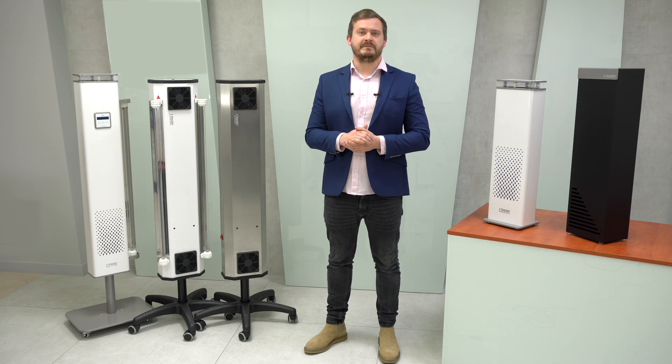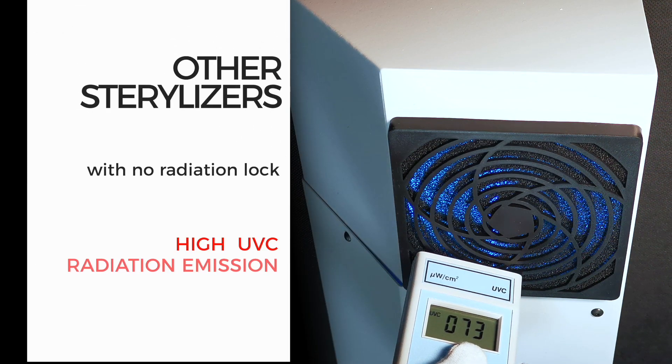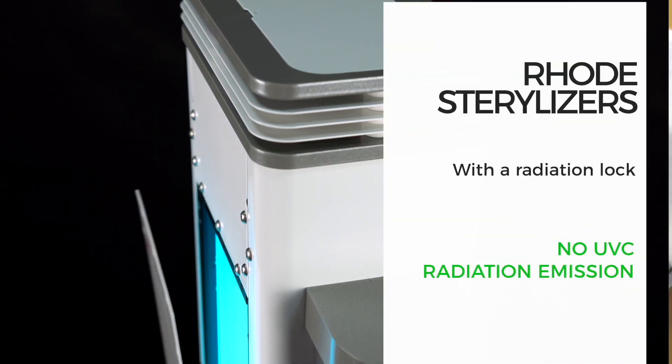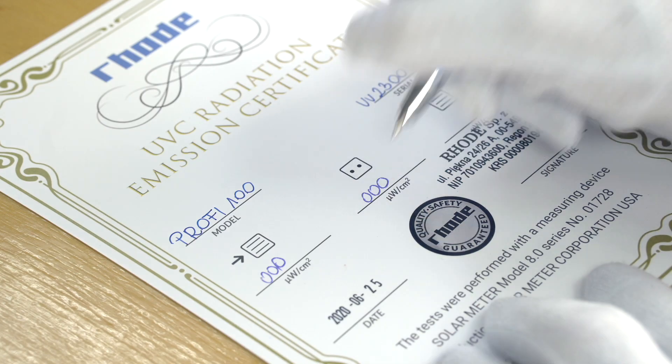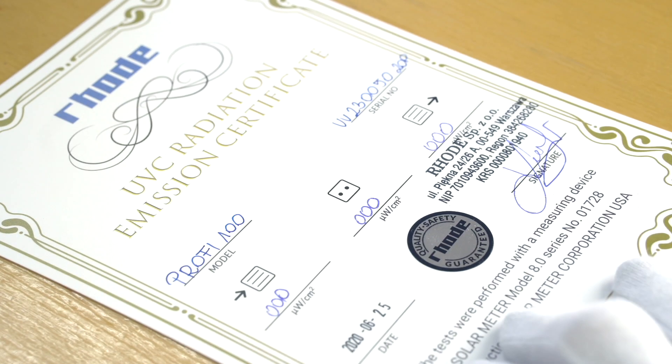The advantage of flow sterilization is that people can be present when the device is operating. That is the main difference from aggressive and dangerous chemical methods such as ozonation or fumigation with hydrogen peroxide. UVC light disinfection technology is safe, but only if the design of the device ensures complete tightness of the radiated chamber. Even a small amount of blue light from the interior indicates low tightness which may result in damage to the user. Rode devices have separators that effectively block radiation emission to the outside, and safety is confirmed by a certificate issued individually for each Rode device.